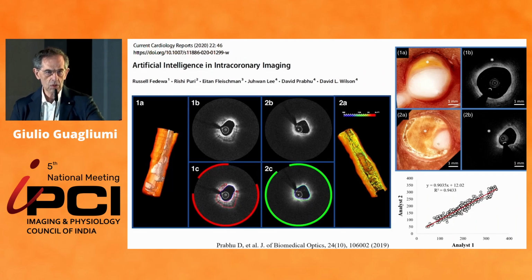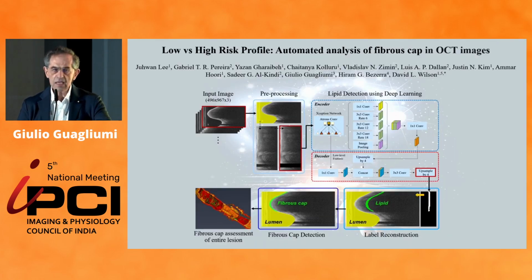What about the future after calcium, lipid? Because we need information about the lipid. Where are we? Is it so far away? It is not so far away. And we are working with one intention, to be able to detect not only the plaque, but to assess the patient and try to get all this information for dividing low versus high risk profile, and eventually to identify quickly the high risk plaque profile.